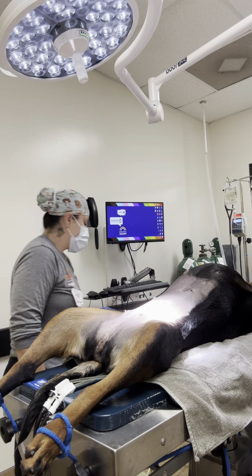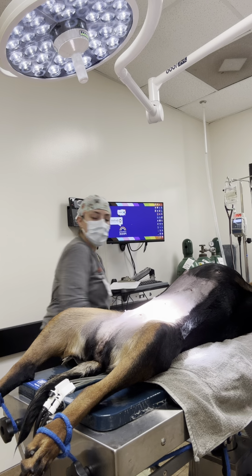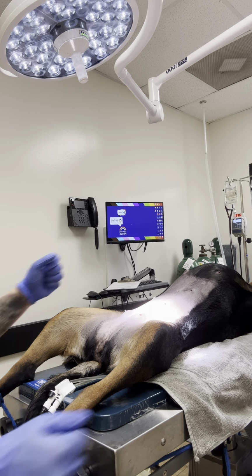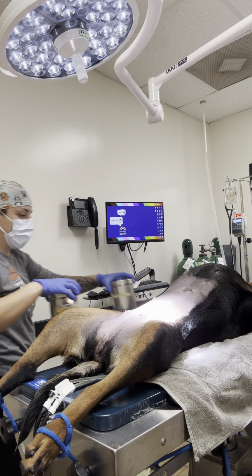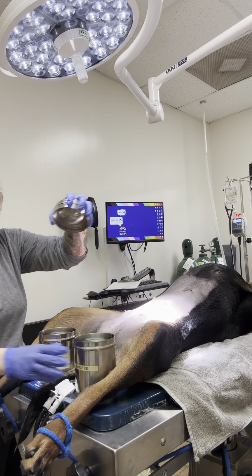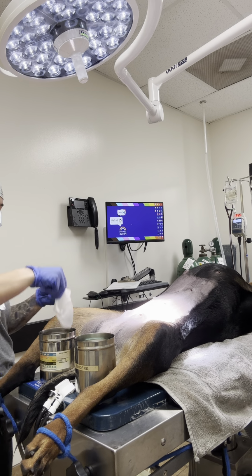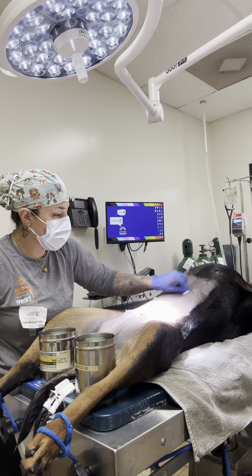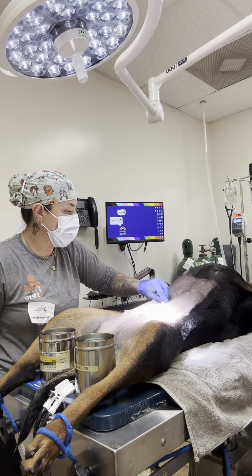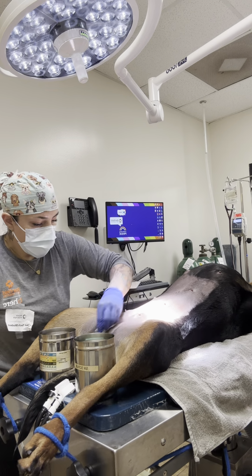We'll also know we went to a tachycardic period. We're coming down. So this is coming down. This isn't going up. When you're doing anesthetics, look at trends. And that's why oftentimes anesthetic death is missing the trends. That you're slowly pushing that pet's heart rate down. You're slowly pushing the perfusion down. You're slowly pushing the SpO2 down or the temperature down. So it's about monitoring and managing those trends effectively.